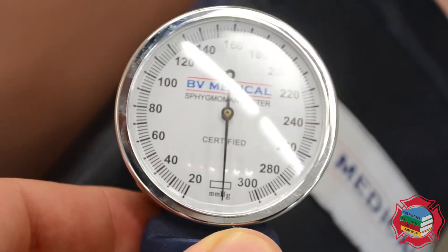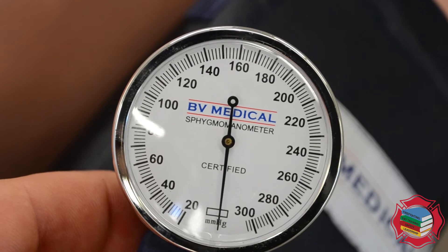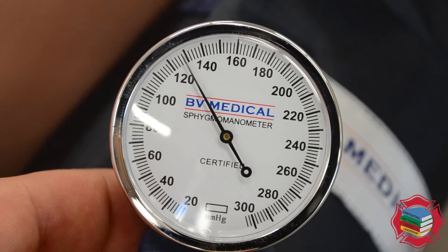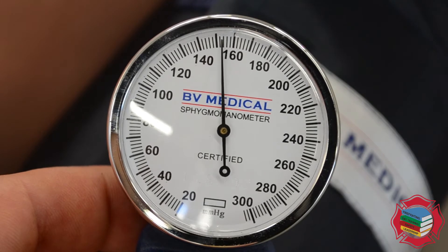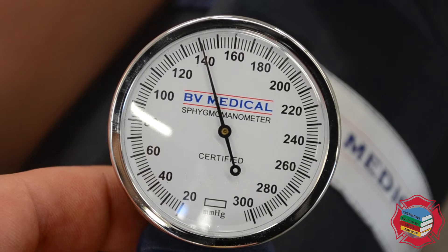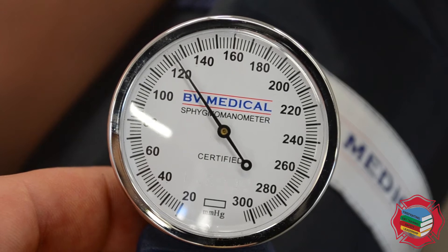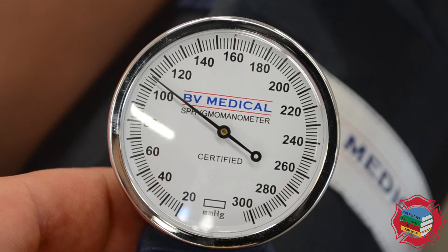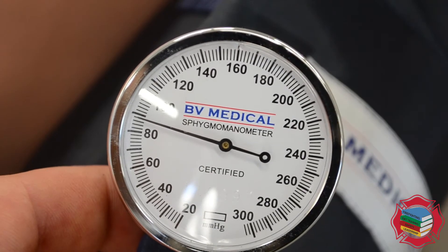Start practicing by rapidly inflating the cuff up to 160 millimeters of mercury and then dropping it at the following rate: the needle should fall at a rate of about two hash marks per second — one, one-thousand — that's about the rate we want. This is how you should be taking your blood pressures. The rate at which you let the needle fall is a direct reflection of how accurate your blood pressure reading will be.